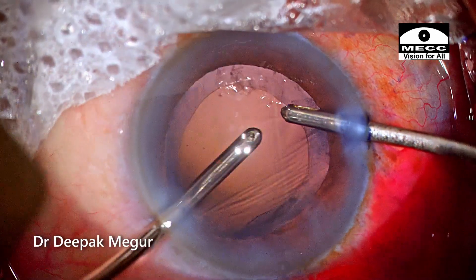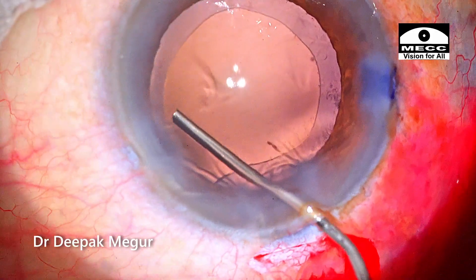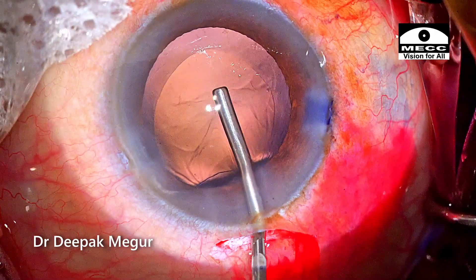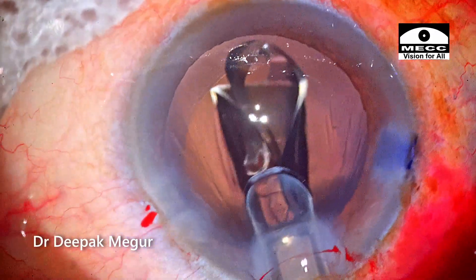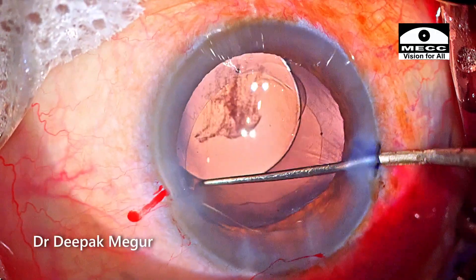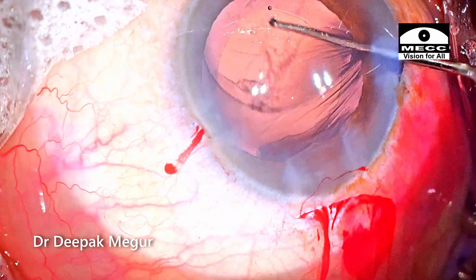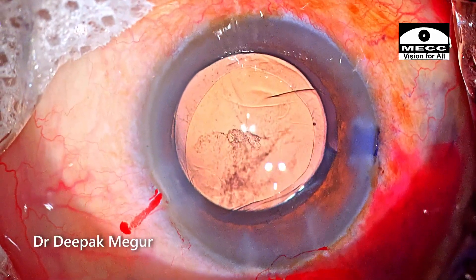Cortex aspiration is completed and now it is time to implant the lens. Although hydroimplantation is my technique of choice, I am using OVD to form the bag and place the lens here, to avoid any unnecessary risk in this situation. As the lens is implanted, it is ensured that the haptics are oriented perpendicular to the axis of the radial tear.